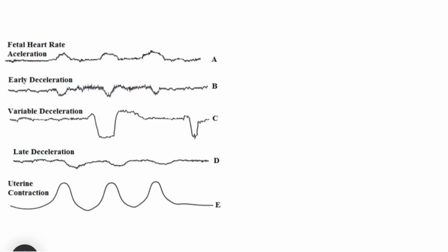Just like ECGs are a fearful topic for the internal medicine doctors, the same fear comes up with CTG in obs-gynae people. CTG is cardiotocography. That means it is an ECG of the heart of the fetus along with the contractions of the uterus. Cardio means fetal heart rate tracing and toco means uterine contraction tracing. So it's very similar to an ECG.